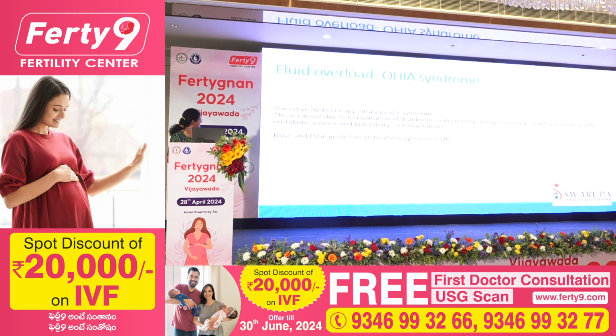Operative hysteroscopy intravascular syndrome is caused by intravasation of the distension media leading to hyponatremia, and if severe, it can lead to metabolic acidosis, pulmonary edema and cerebral edema. As I have mentioned before, remember the British Society for Endoscopy guidelines and European Society for Endoscopy guidelines. Do remember to go back and read the article which I have mentioned before for the fluid dynamics.